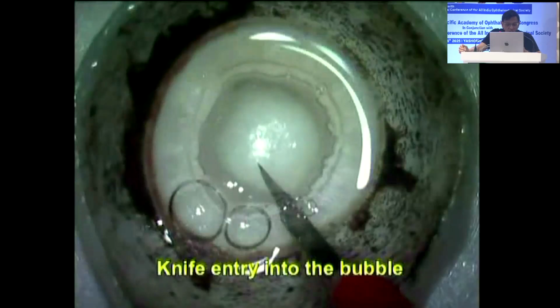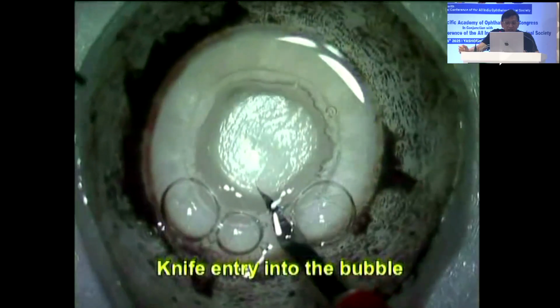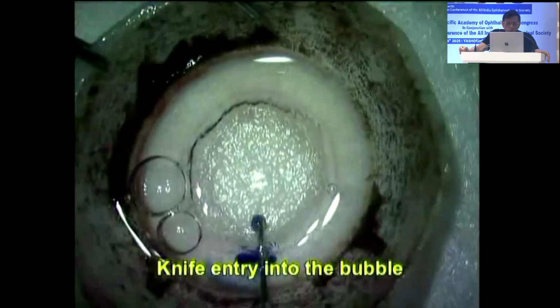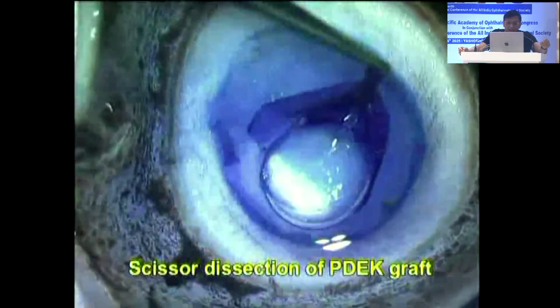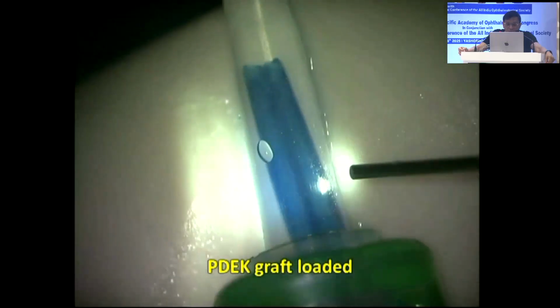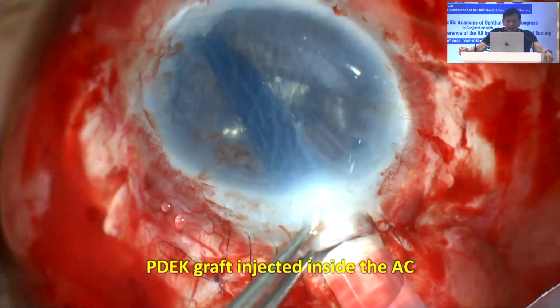Another issue is, you can manipulate the graft very easily. So here you have created a type 1 bubble. Just to complete this case, we'll just show you the ending of this case. I prepare my PDEK graft, inject it inside. Now let's see how the patient does at the end of the day.